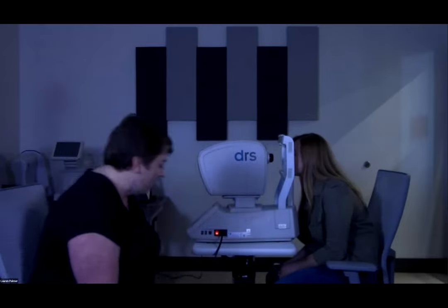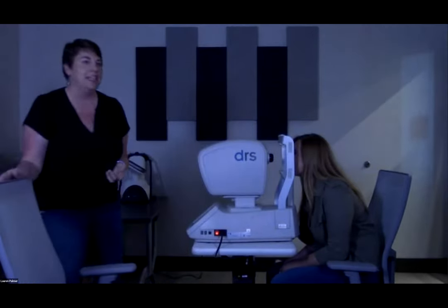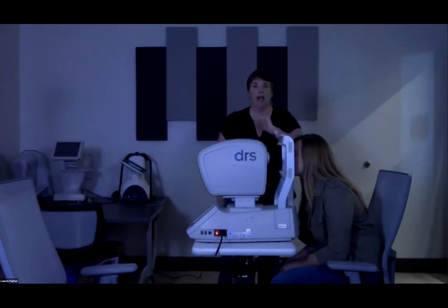So Rebecca is going to act as my patient. The first thing that we want to make sure, again, is that the patient understands their role in the exam. So we need to clearly explain to them what the expectation is in terms of their positioning. Rebecca is already modeling one of the primary opportunities that we often see. The patient's forehead is not resting against the forehead bar.